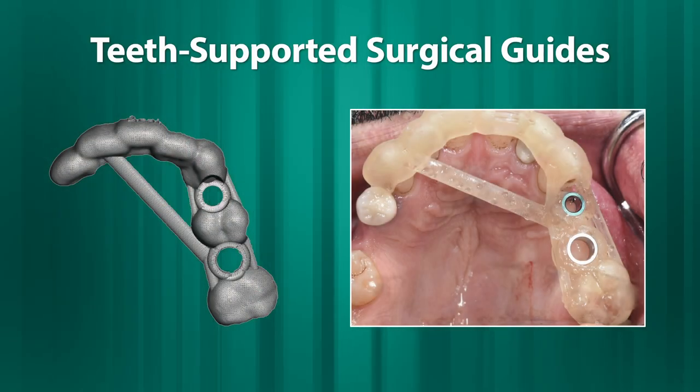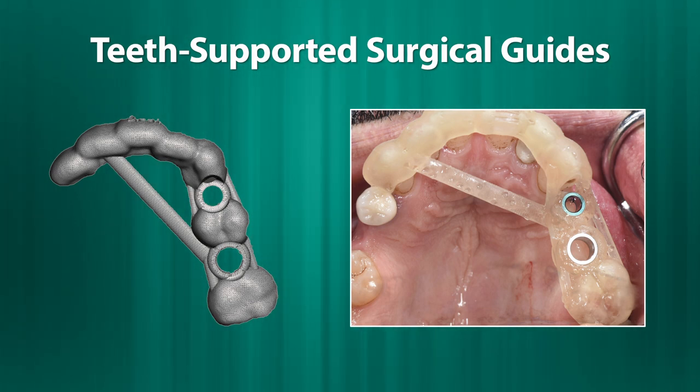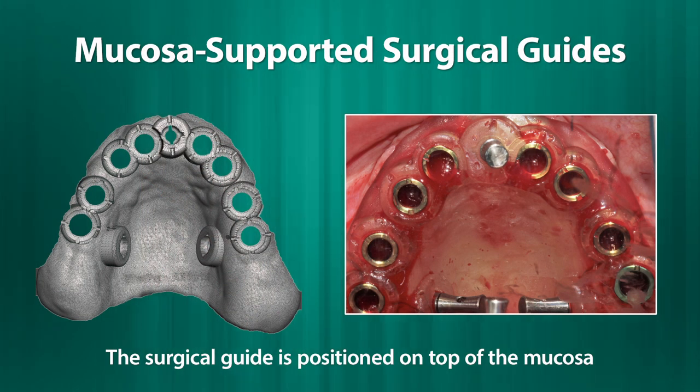The implant planning software can facilitate the design of the different surgical guides. We have either teeth-supported surgical guides, which have to rest on teeth during drilling and implant insertion, or you might use a bone-supported surgical guide, which requires opening a mucoperiosteal flap, and in this case the surgical guide has to be fixed on bone using anchor pins or titanium screws. The third type is a mucosa-supported surgical guide, which rests on the mucosa and allows you to perform flapless surgery in a completely edentulous arch.